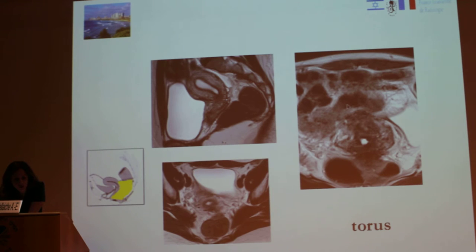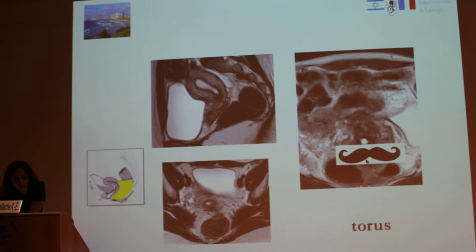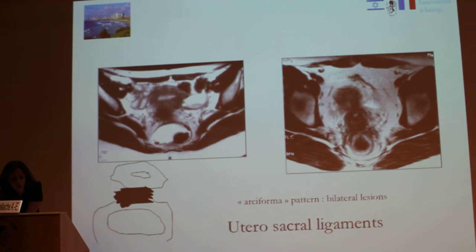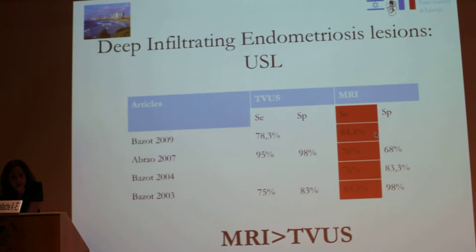The torus uterinum shows a hypersignal T2 lesion typical of endometriosis, like a mustache pattern. Here you can see another example of uterosacral ligament involvement with hypersignal nodules and uterosacral ligament thickening visible on the axial sequence.